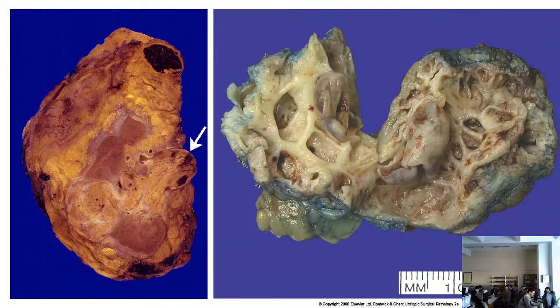It's the hemorrhagic infarct, not the pale one we previously saw, which is caused either when we have vein blockage or when we have artery acute blockage, but there is adjacent circulation. In this case, we have a venous infarct, a venous occlusion by the tumor itself.